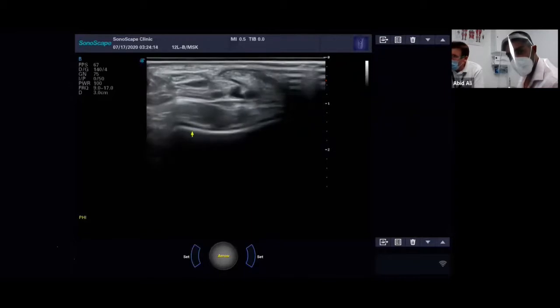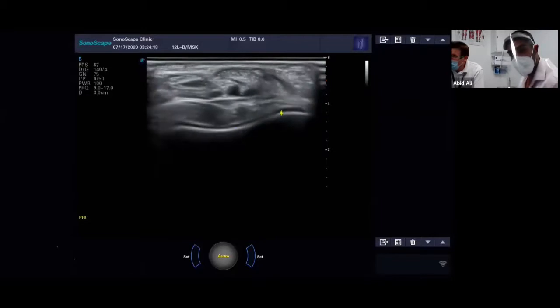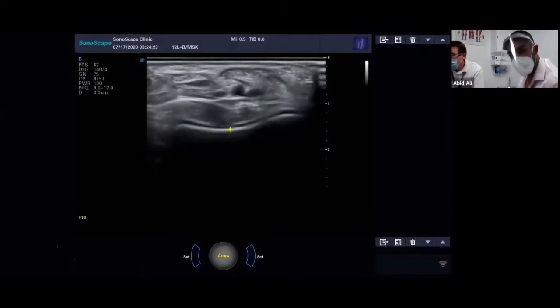It's a nice mortise view here, look. That's the next layer Adrian's just pointed out with the yellow marker. That's actually the head of your talus. And this black line overlying it is the hyaline cartilage.